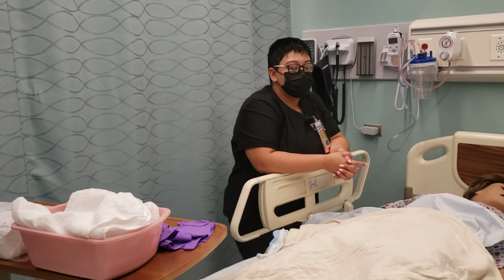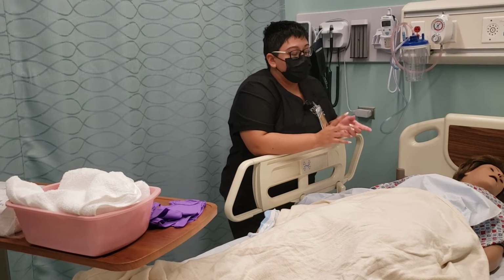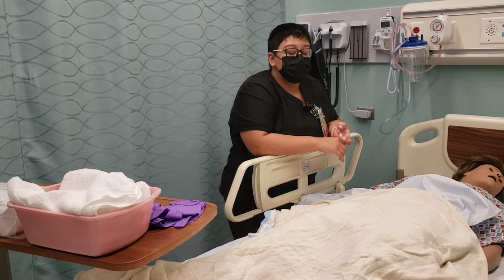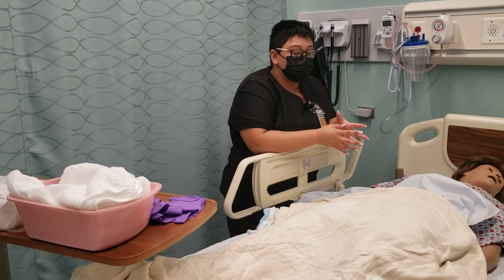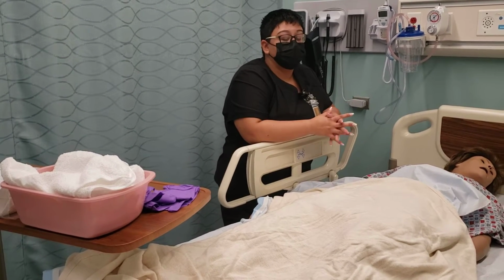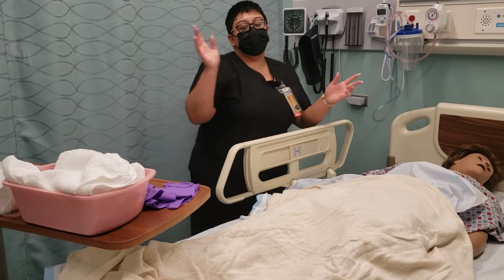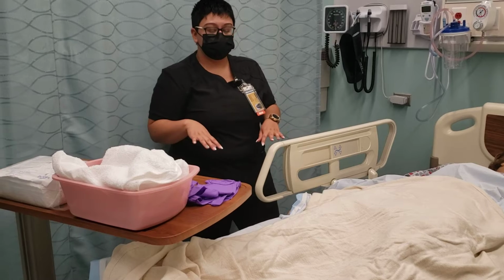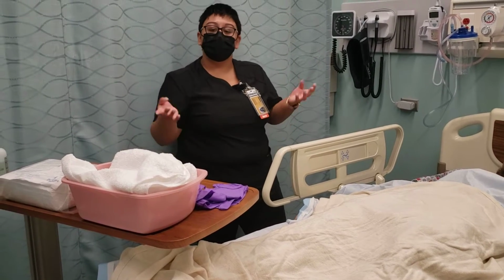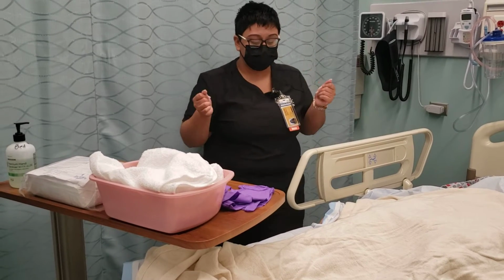I have already checked my patient's medical record and checked for their mobility, any allergies that they might have, any medications, drains, Foley's, IVs, and confirmed that I have an order from the physician to place an indwelling catheter. I already washed my hands prior to entering the patient's room, and I would put on PPE as indicated. Today it's universal precautions, so I just need my mask for COVID.